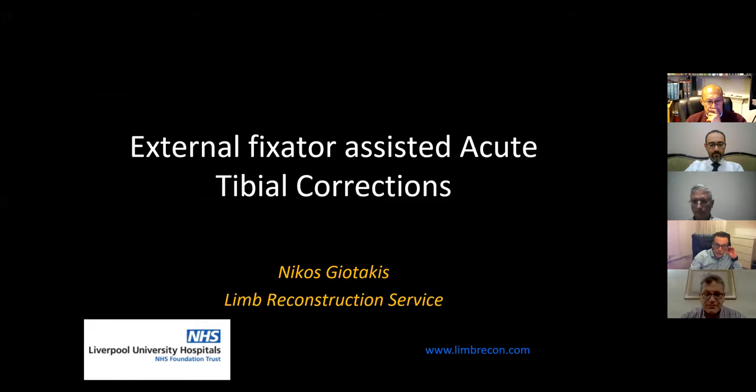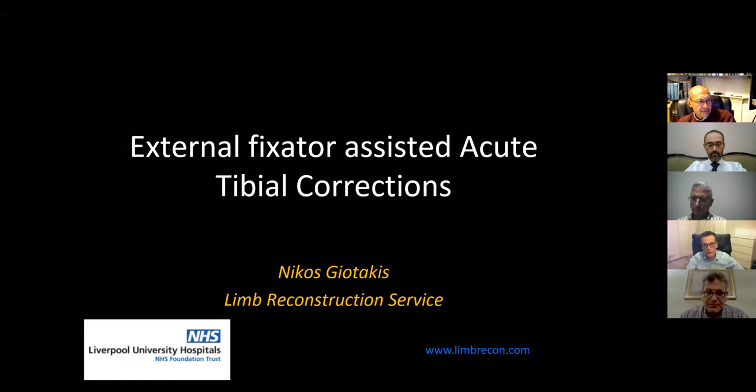So the goal of my talk will be to illustrate a technique that has been widely used in our unit for some years now on correcting deformities using external fixation as a tool that assists an acute correction, while we use the internal fixation as the definitive method. We have heard from the previous speakers, Professor Ahmed in particular, on the issues with acute correction, on how many limitations there are, and we're all aware that gradual correction and the use of external fixation, particularly circular frames, are a pretty safe bet on achieving the goal.